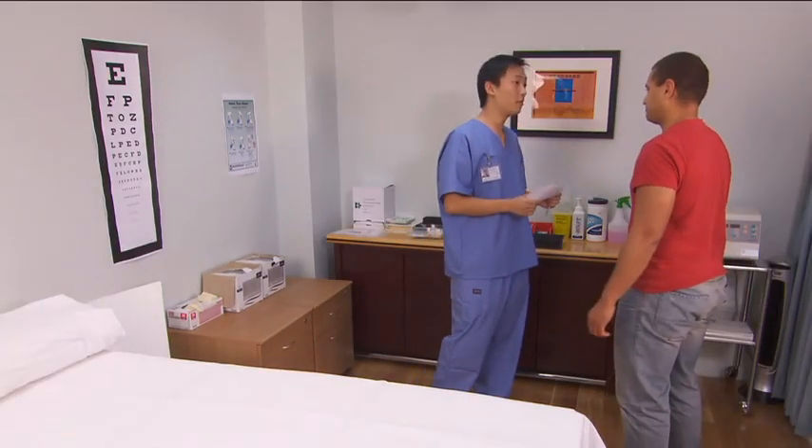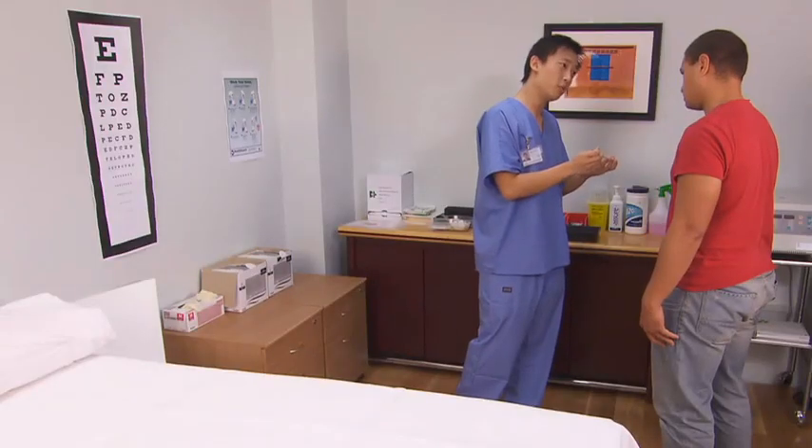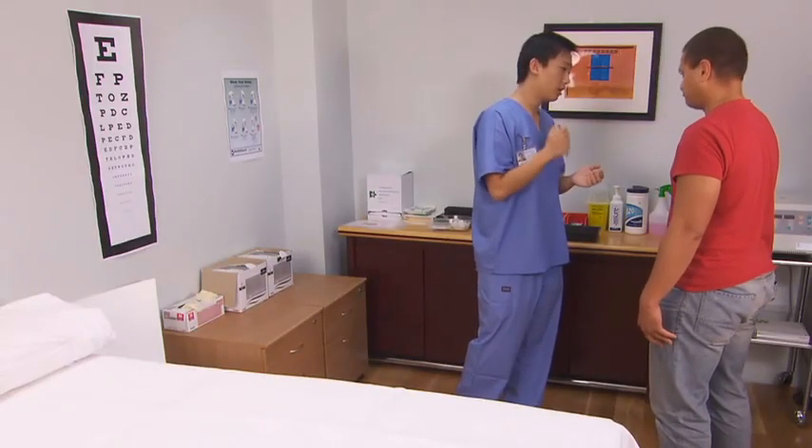Confirm the patient details, explain the procedure, and address any concerns. Let the patient know that there may be some discomfort and obtain verbal consent before beginning the procedure.